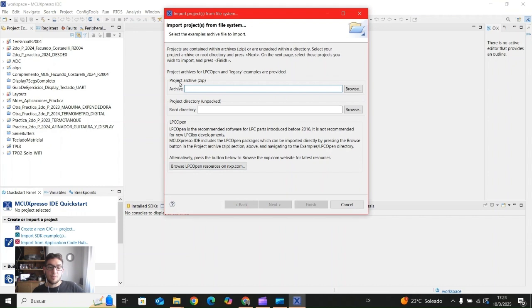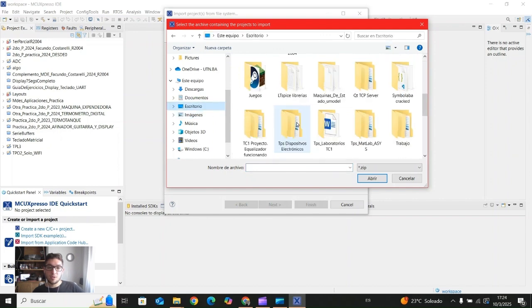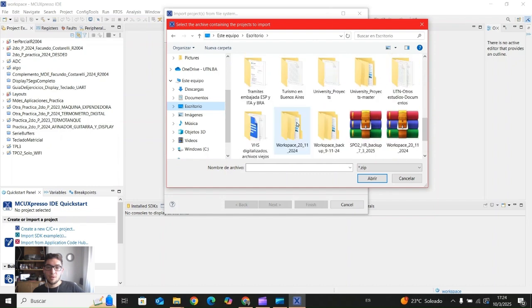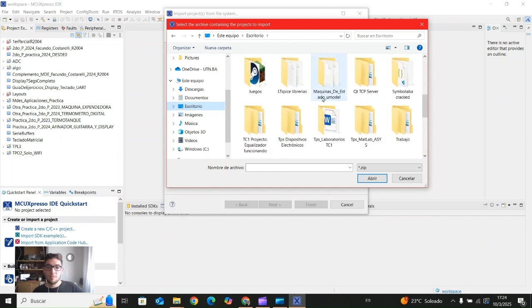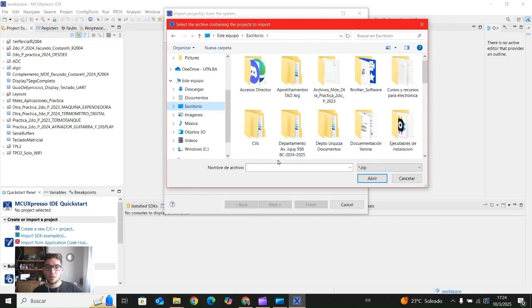We see that we are in project archive zip. We click on browse. Then we look for that zip file that I mentioned before, microcontroller.zip, which is inside University Projects on the desktop.